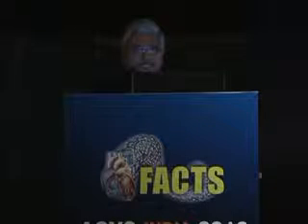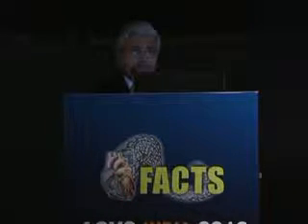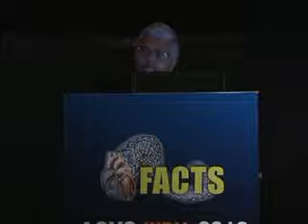Because of the proximity to the tricuspid valve chordal mechanism, this patient had a TEE put in so that we were certain that we were not entrapping any chordae. So this was the final result. Unlike adults, the dilated coronary artery in children has a better chance of resolving with passage of time.